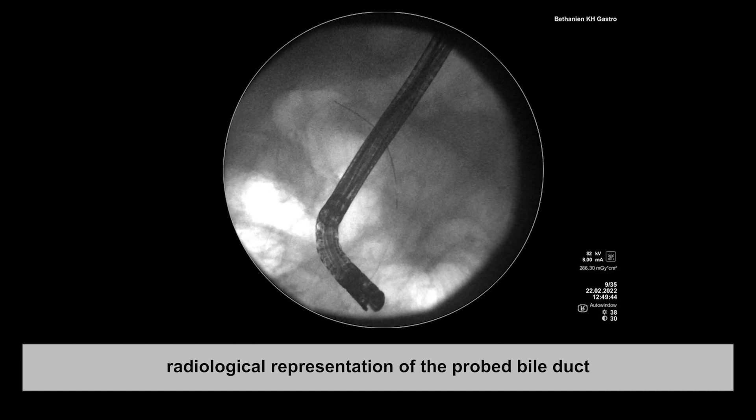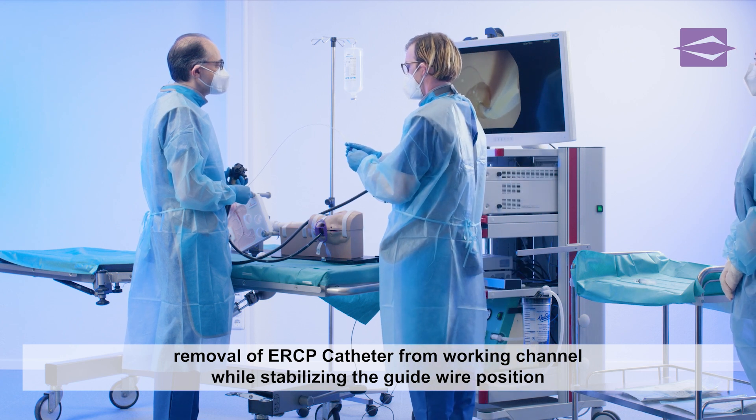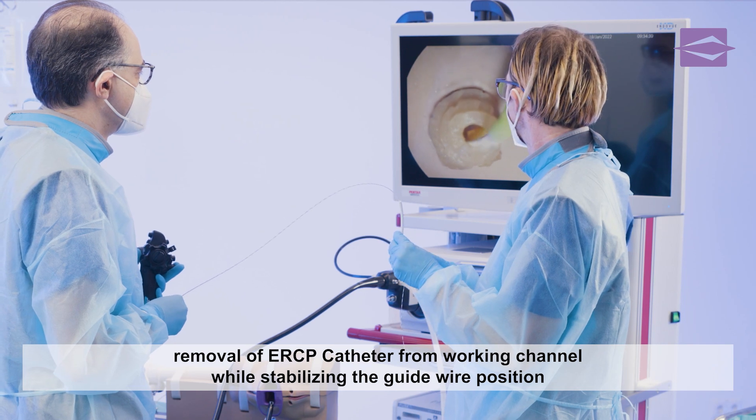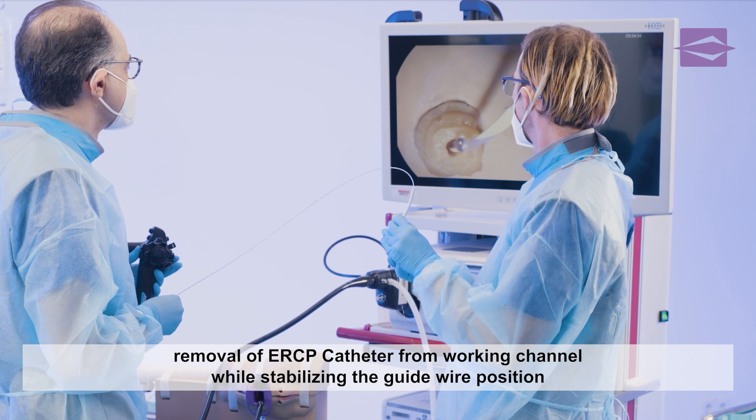The ERCP catheter can now be removed from the working channel. It is important to ensure that the guide wire placed in the bile duct remains stable in its position in order to act as a navigation aid for further therapy steps.